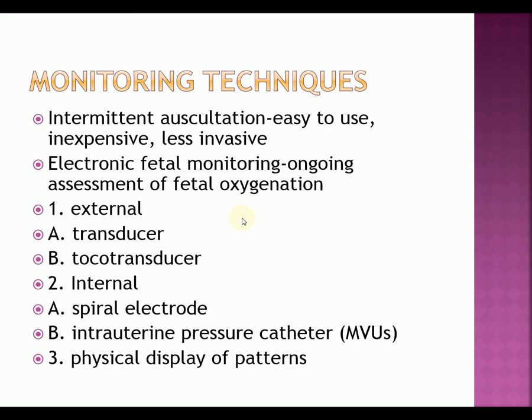Although you can get them up out of bed and get them on a ball, get them in a rocking chair, let them do some swaying, as long as they're still connected to the monitor and the monitor is still picking up contractions. And like I said, it's really difficult sometimes for an external monitor to stay. If you've got a very active baby, if you've got someone that's obese, this is where you might be looking at an internal for fetal monitoring.